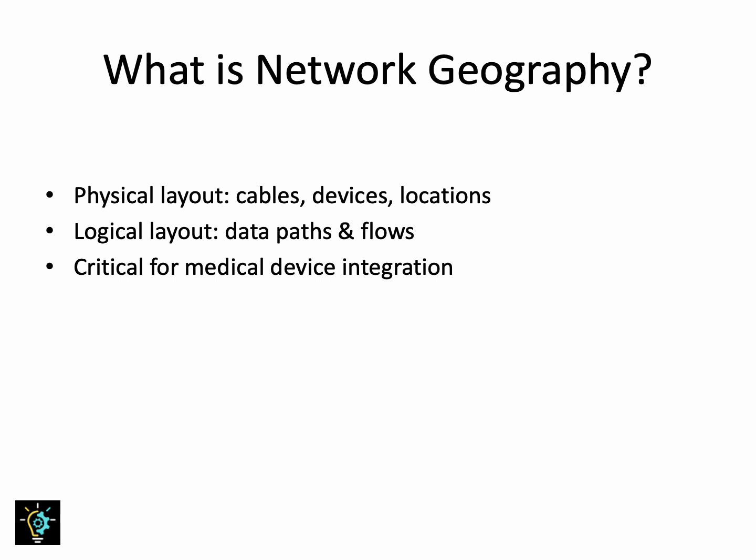Imagine an MRI machine that's physically located in the basement, but its images need to be sent to radiologists 3 floors up. The physical wiring and the logical routes determine how fast and reliably that happens. Without careful planning, data could take inefficient paths or even face congestion.